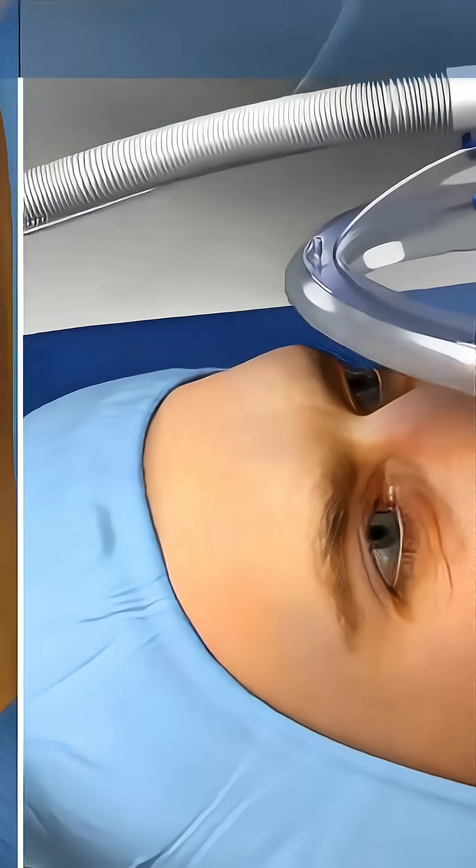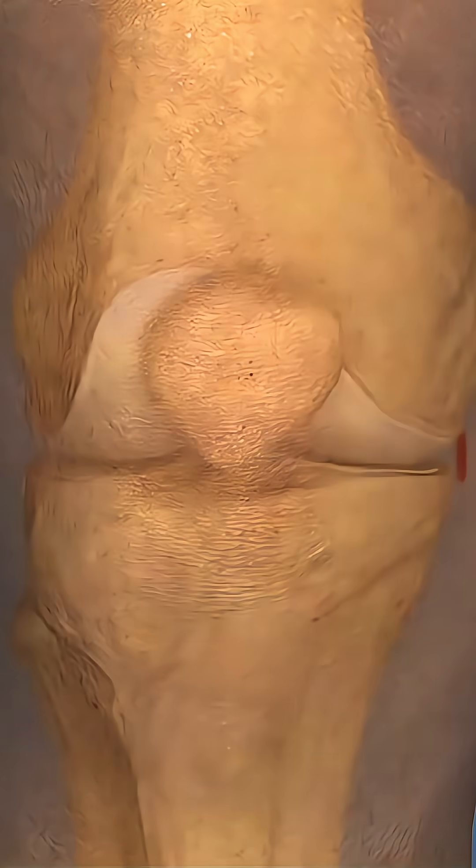Under spinal or general anesthesia, the patient is positioned supine with the knee flexed.